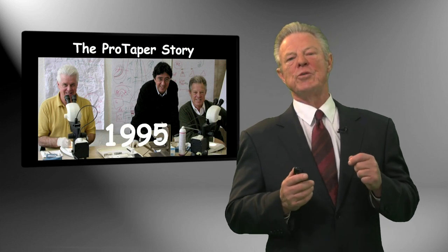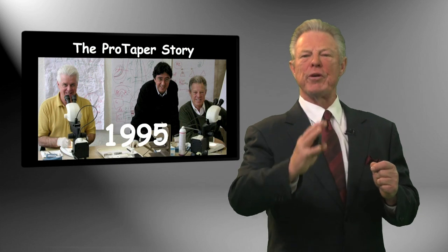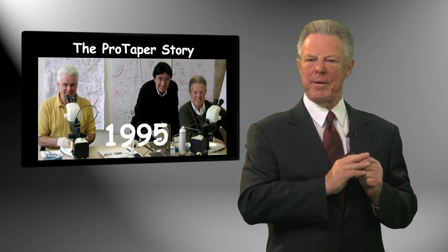And we began to think of what could we do in terms of the Schilder principles of progressive shaping. How could we put that in nickel titanium? And this is where ProTaper was born.